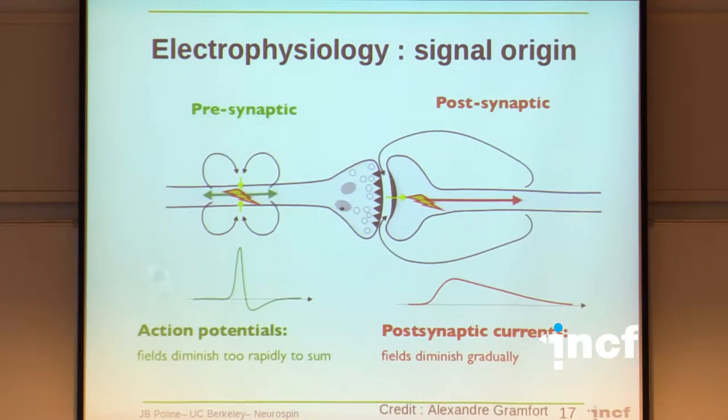So EEG-MEG is very widespread. EEG is extremely widespread. The clinical aspect of that is mostly epilepsy, but also other things. Both are used for research, but MEG is the more interesting machine. It's beautiful. You've got a very elegant hat on the head, and it's basically measuring the little electric current that the neurons are producing. So let me give a quick recall of that.